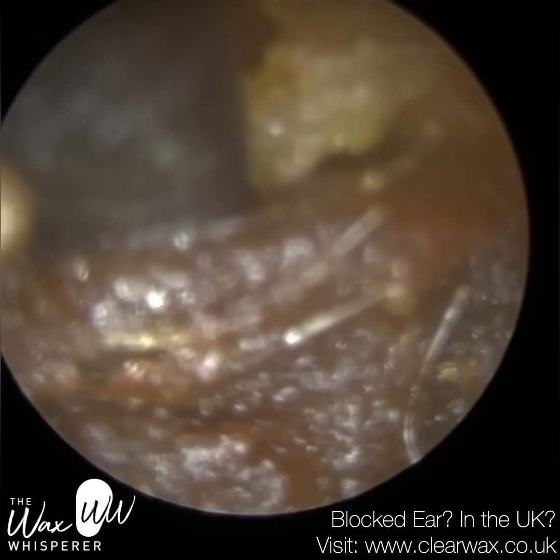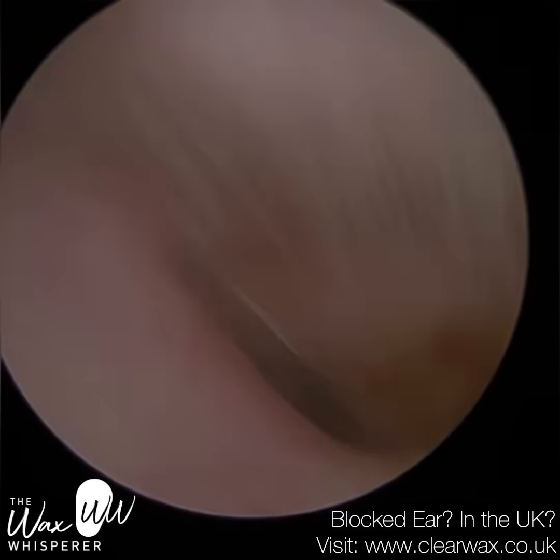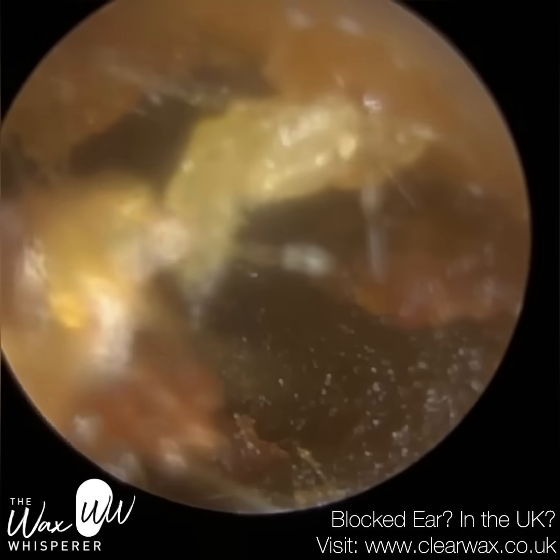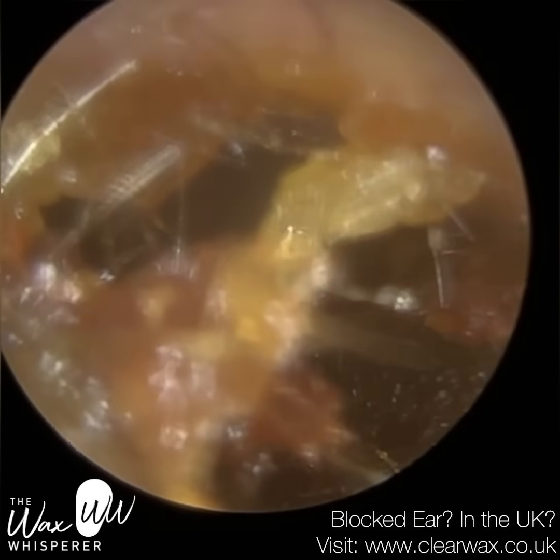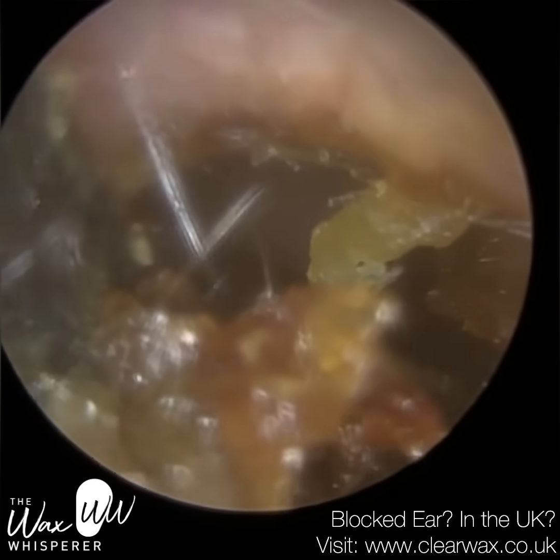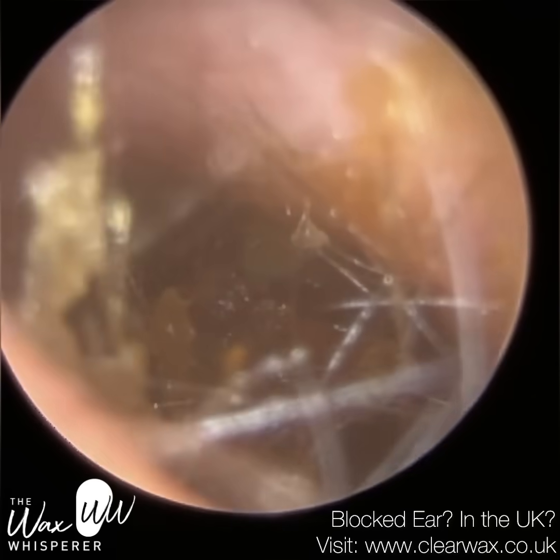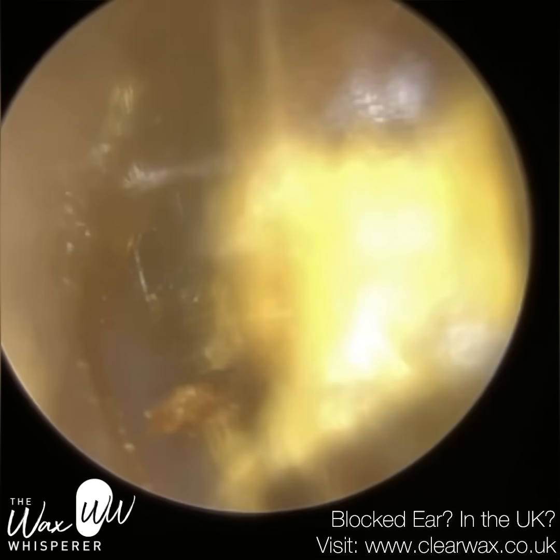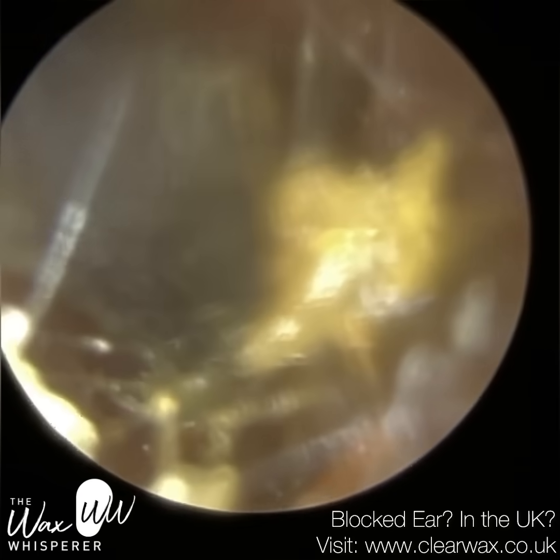Most earwax removal manual instruments, in the UK at least, are straight handled. If you wait till the end of the video, you're going to see a still image of this Rykerette that gives you an idea of what I'm referring to. Having the bend in there not only gives me more reach inside the ear, but it also provides more manoeuvrability. Additionally, it prevents your hands crossing over, and it also prevents the earwax view being obstructed.